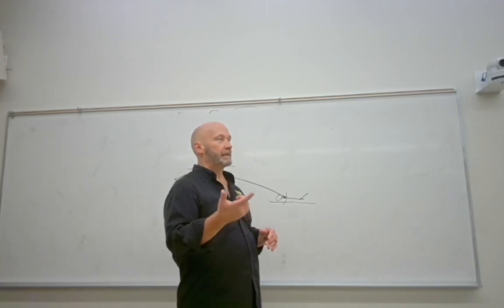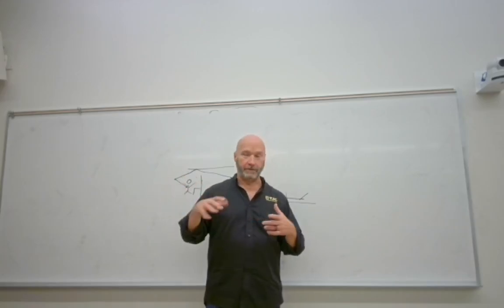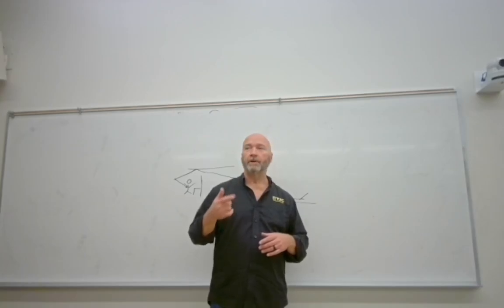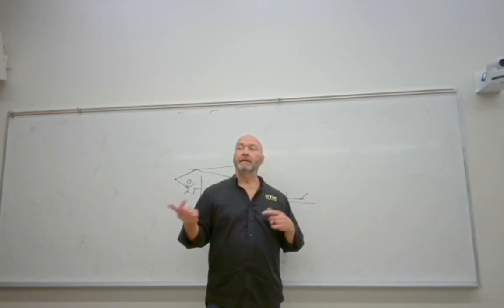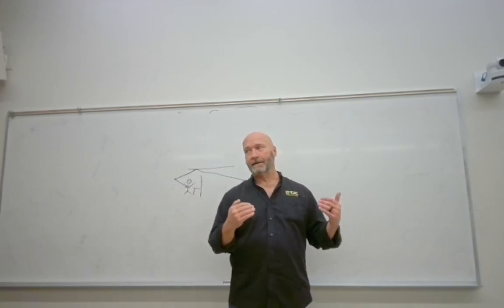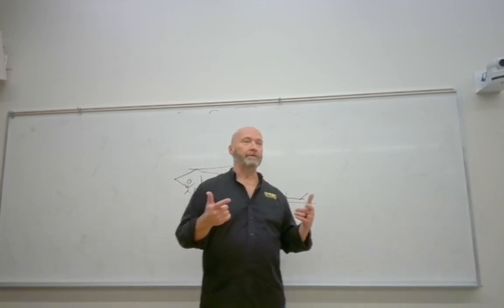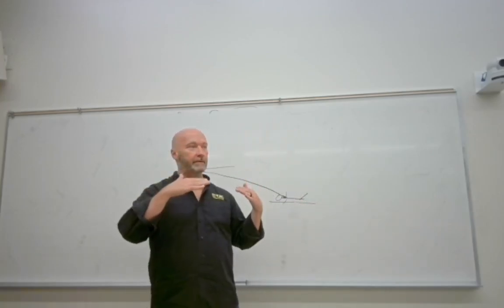So you go into clinicals tomorrow, you go to lab today, you're going to see a floating tabletop. You go into clinicals tomorrow, go into an RF room and see how the tabletop moves. It's going to be motor driven, so that whenever you're not driving the motor, it's solid. It's not going anywhere. All right. Another distinguishing characteristic is that those RF rooms are going to have that ability to tilt.